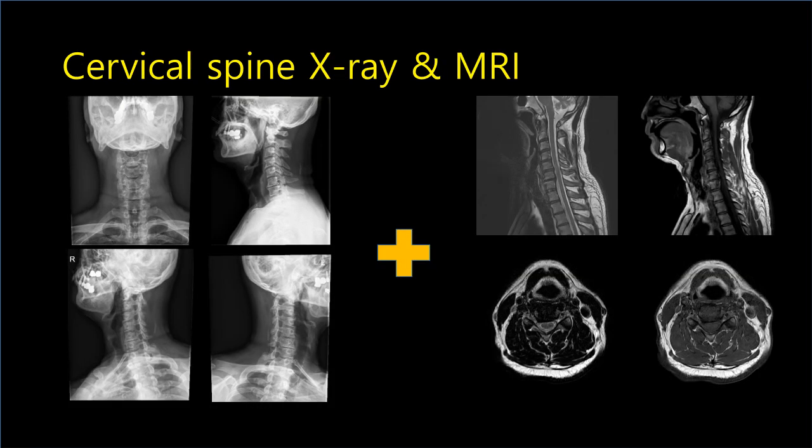To evaluate cervical neural foramen stenosis, radiography and MRI are taken together, and it is difficult to evaluate well with only sagittal and axial images in MRI examination. For this reason, additional MRI oblique images are being used.